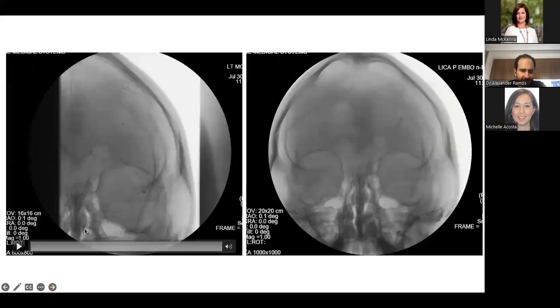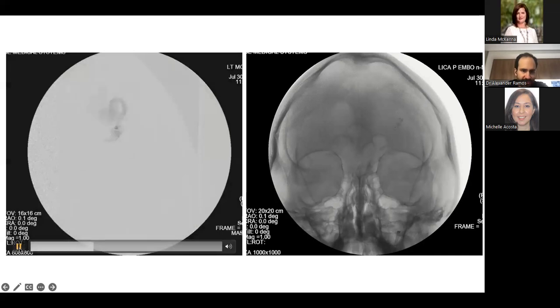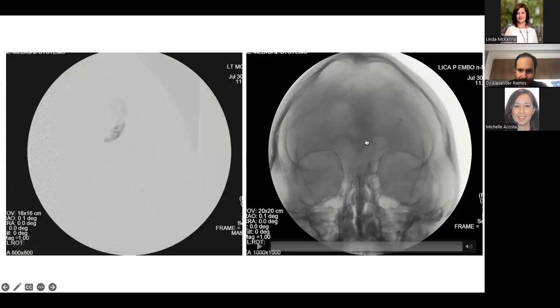So we had to treat that. I don't know if you can appreciate here, but this is our catheter. This is how we actually do these procedures. You can trace it. This is our microcatheter and it's going in the blood vessels all the way around, loop to loop, all the way up to here. That's the tip of our microcatheter. We thread it all the way up there. We do an injection. You can see we're right there where the aneurysm is.